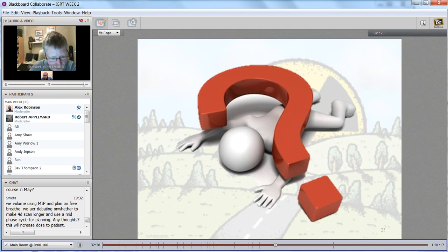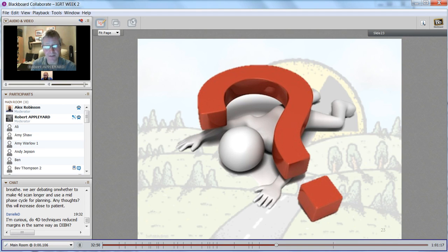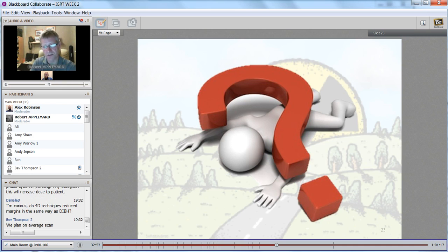That's great, Alex. Thank you. Ben is asking, would MIP be covered on the contouring course in May? I guess so. And one or two people have made comments here that, just to echo what you said there, Alex, it's not perfect, and they then use a movie loop to check. So it's just a time-saving device.